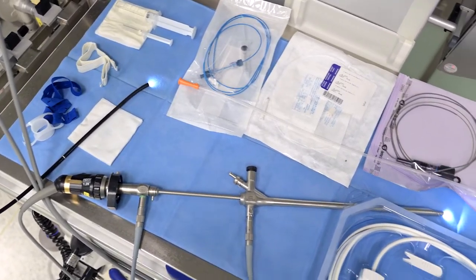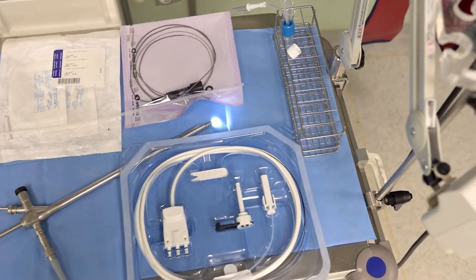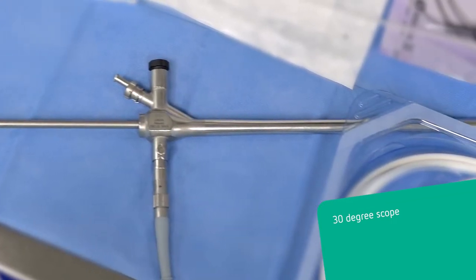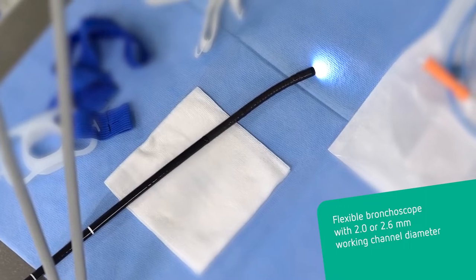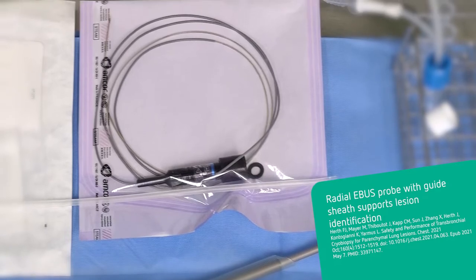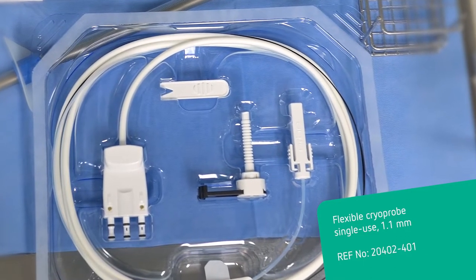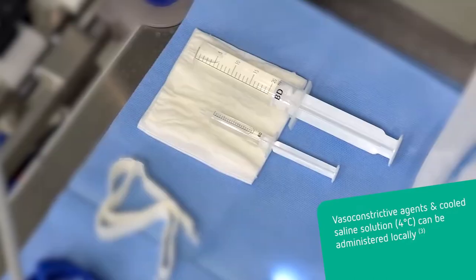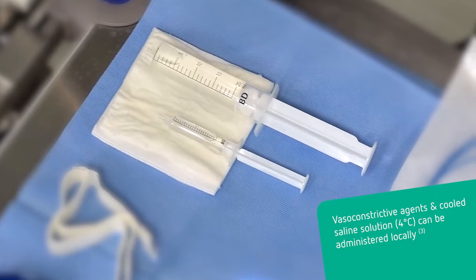In preparation for a cryobiopsy using rigid intubation, the following tools are prepared. The team at Torax Clinic Heidelbach uses a rigid 30-degree scope. A flexible bronchoscope with a working channel of 2.0 mm or 2.6 mm in diameter, suitable for the radial E-BUS guide sheath, is used alongside a flexible single-use 1.1 mm cryoprobe. A dedicated container serves for sample thawing and storage. Ice-cold saline is available to control clinically significant bleeding, and an anti-fogging agent for medical endoscopes can also be used.